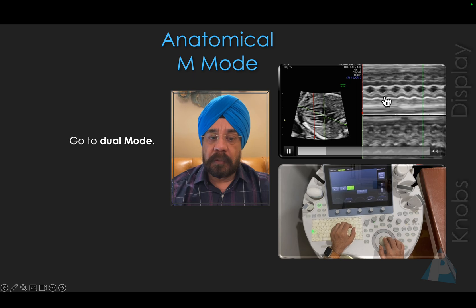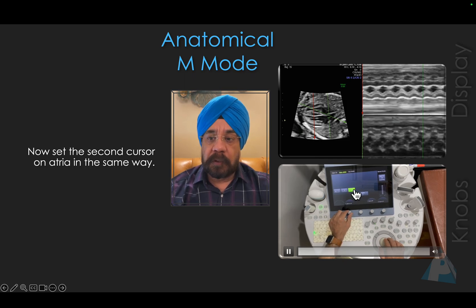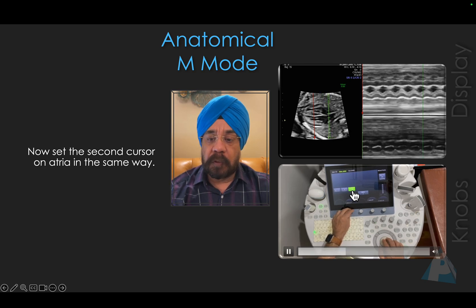Then you go to dual mode, which is displayed here. You select a new set of M-Mode and repeat the same process — rotating the angle to get the best atrial contraction in dual mode. This is single mode; this is dual mode.